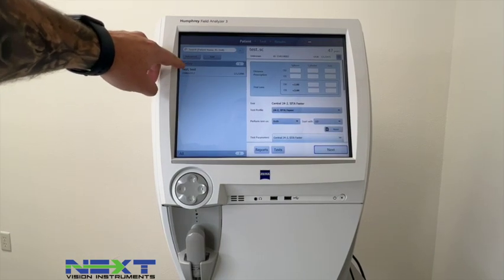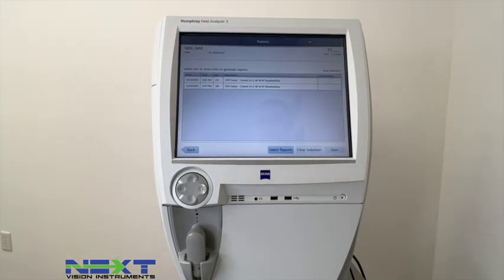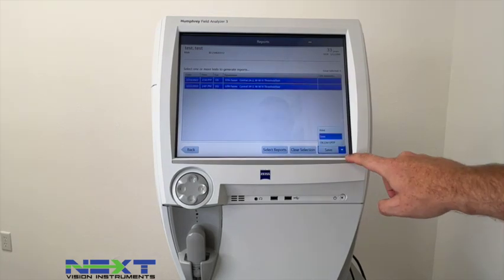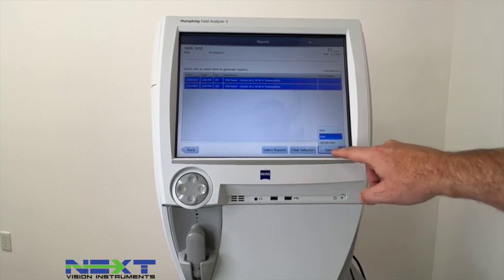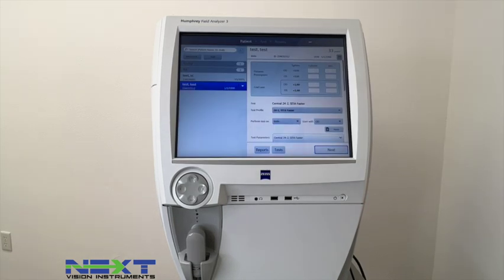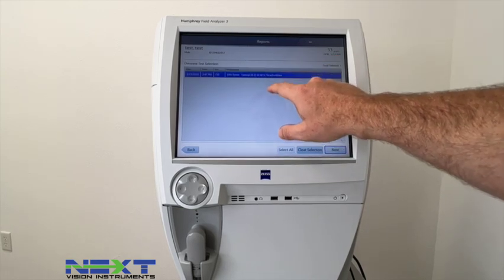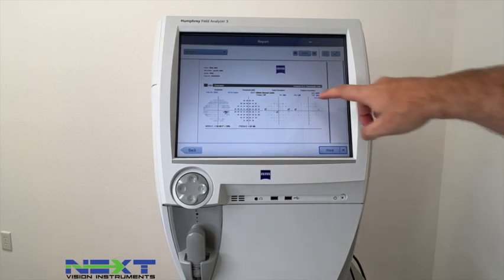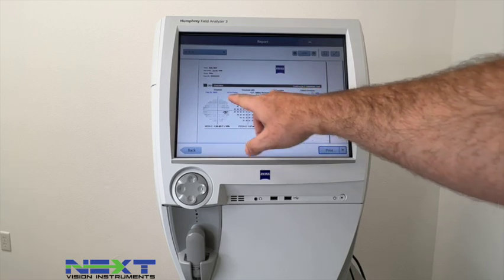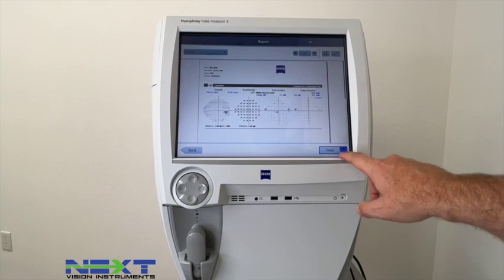After saving, go to Today to pull up the test you just entered — you can select All or Today. Go to Reports and from here you can print, save to an external USB, or export to DICOM. To pull up a report from the past or one just run, select the down arrow then Next and this is the report that will print out for the right eye, showing all the test details. From here you can also print, export, or save.